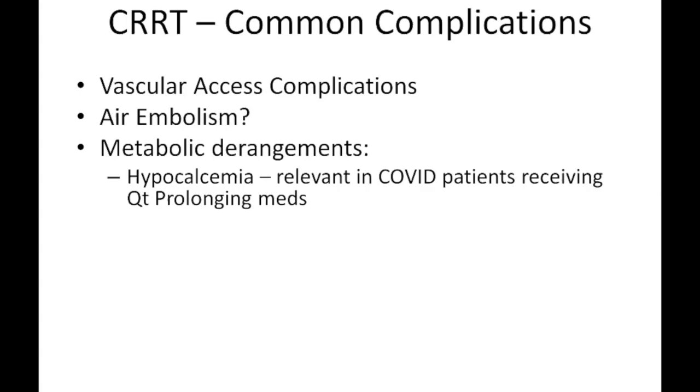If citrate anticoagulation is in use and the serum calcium is low, and enough calcium replacement fluid is not being run, then a patient can get hypocalcemia quite quickly. This is generally well tolerated, and most of the time the protocol runs very well.